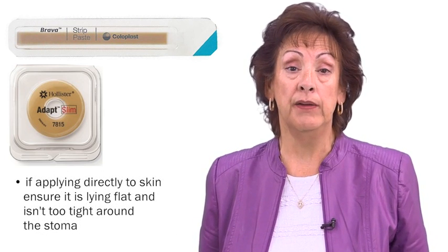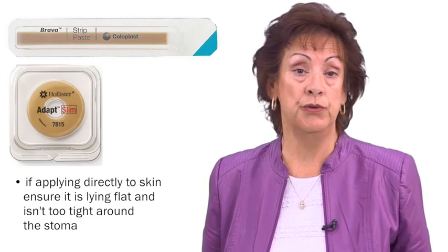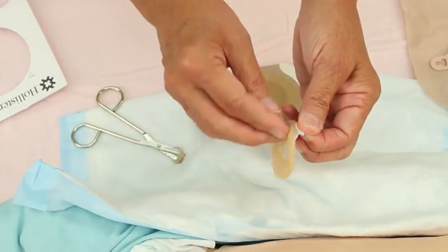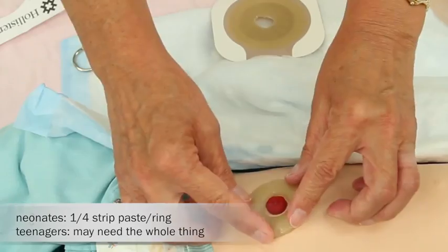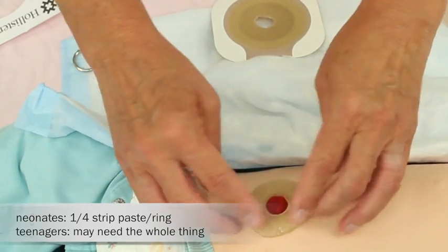If placing the paste on the skin, be sure it is laying flat on the skin and not too tight around the stoma. The amount of paste will depend on the size of the child and any specific issues they are having. Generally, a neonate will only need a quarter piece of the strip paste or barrier ring, while a teenager may need the entire thing.